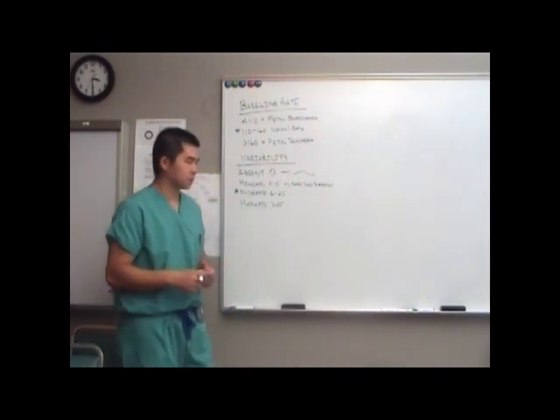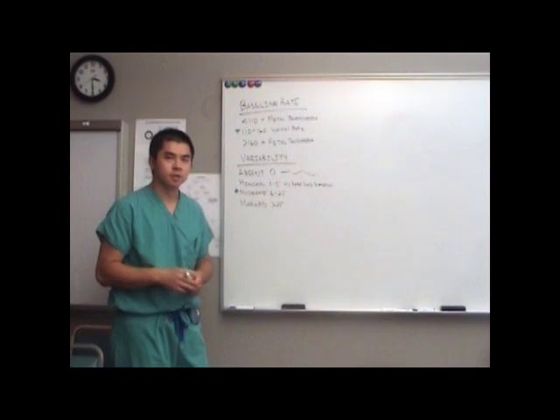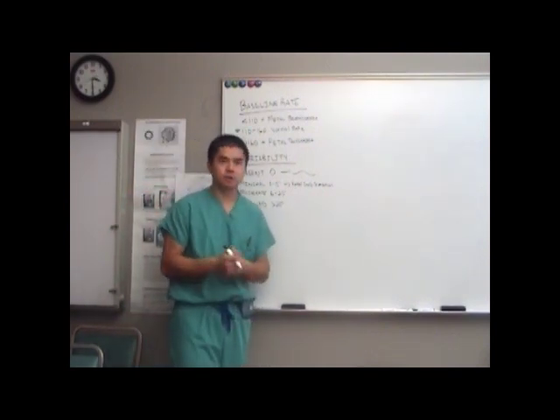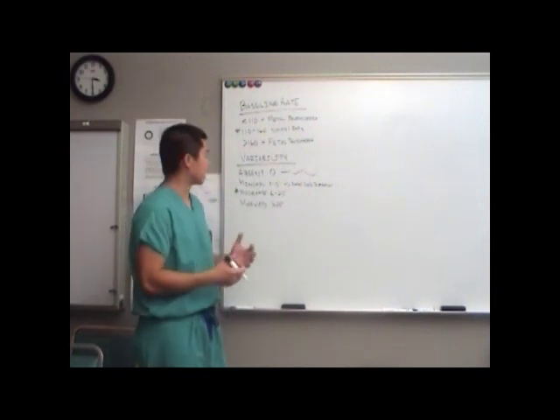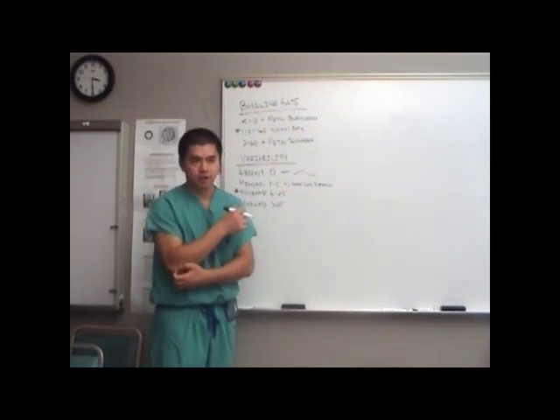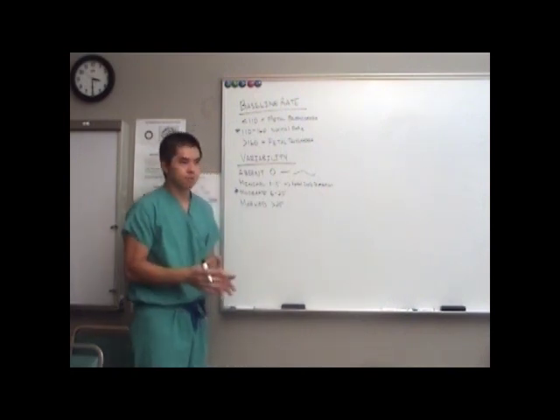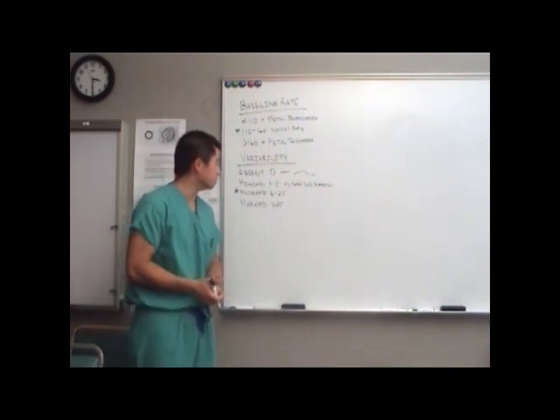What are some iatrogenic things that we do that cause minimal variability? Yeah, if we give IV narcotics, morphine, fentanyl, it can cause minimal variability. That effect isn't permanent, but just keep that in mind. Again, you're keeping the context of your patient in mind when you're interpreting these heart tones.